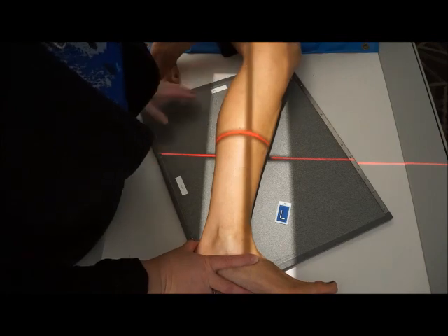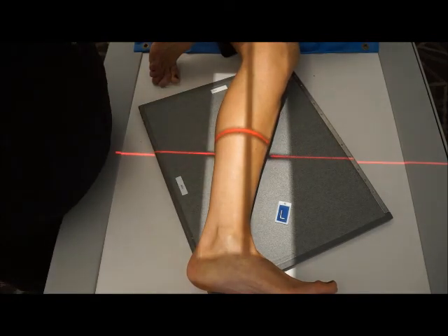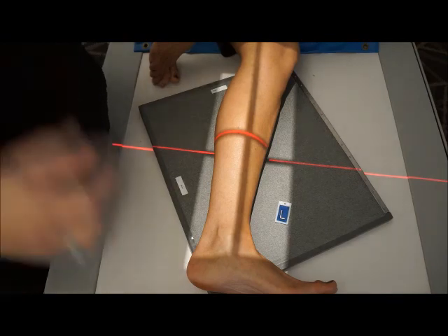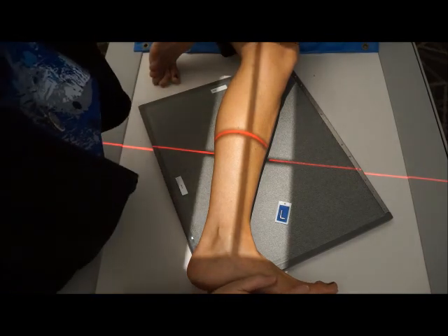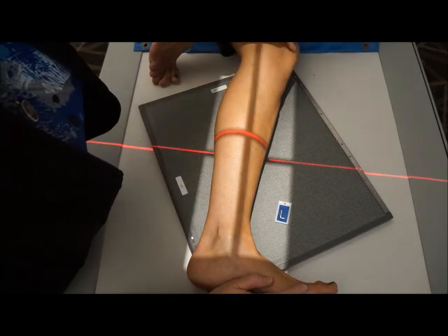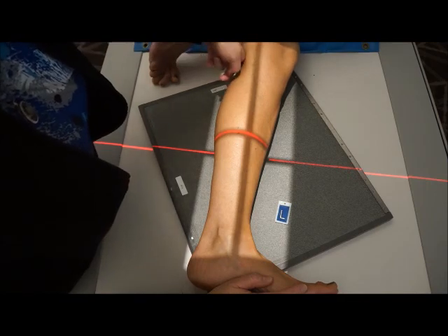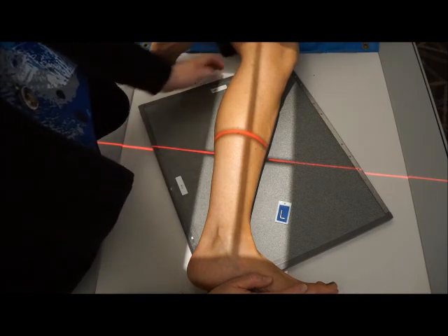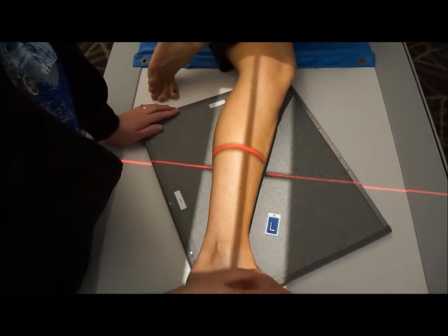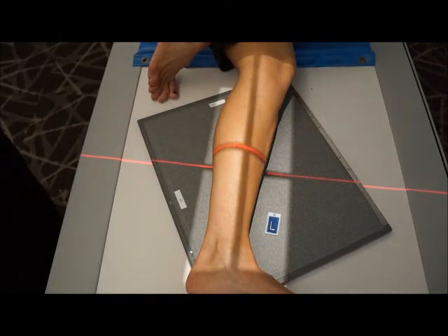I'm going to turn my collimator box. Collimation is going to remain the same. I know you can't see it from here, but I've clearly got the knee joint popliteal crease right here and I can see I've got my light field. Both malleoli need to be on the image.